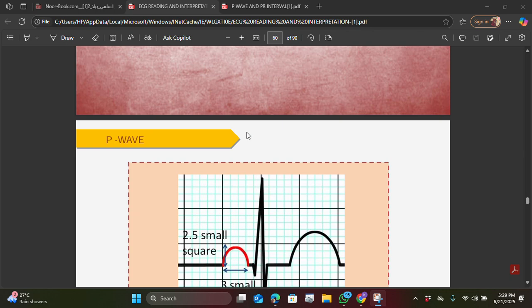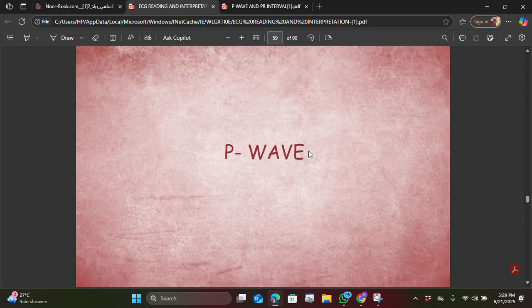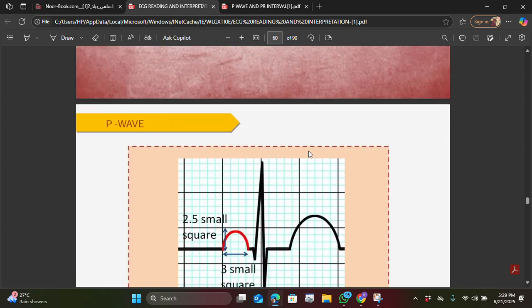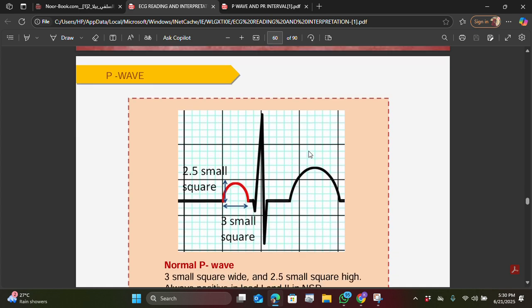So yeah, this week we are going to start with P wave, and then continue to PR interval. Like you guys know, I told you what P wave stands for. What did I say P wave stands for? Everybody in the class. P wave stands for atrial depolarization. Okay.